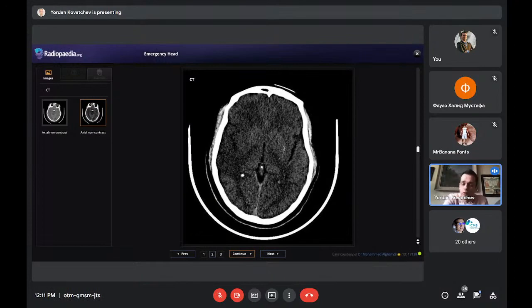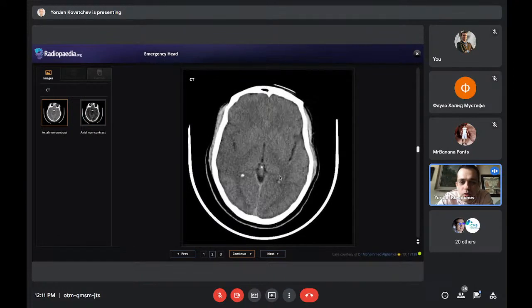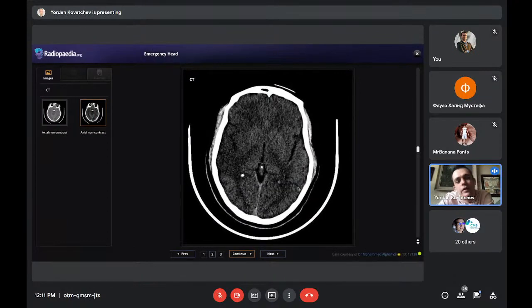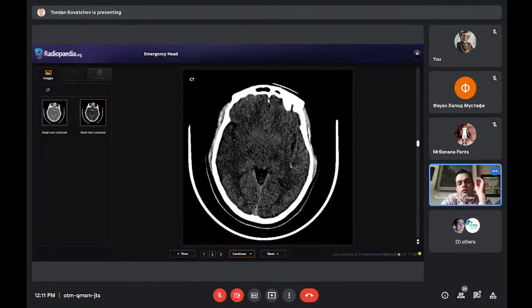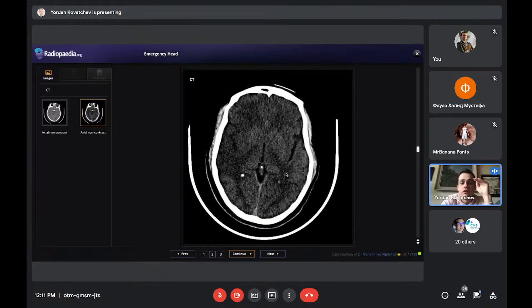What we see, however, is basically the same case, but it's so important that's why I'm showing it to you again on another patient. A patient with left side weakness, and we see the loss of the insular ribbon sign here. It's more subtle, right? It was a bit more evident on the first patient, but on this patient it's kind of hard to see. It's not a great scan as well. And we do the windowing, and then we compare. Even if you're not so experienced, all you have to notice is there is some change. There is some pattern. There is something going on, and then you figure it out, I promise you.